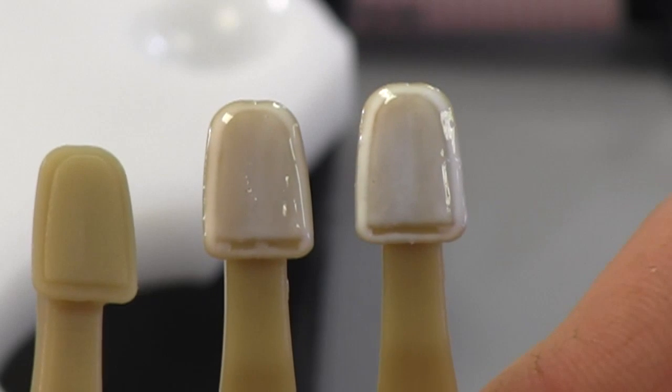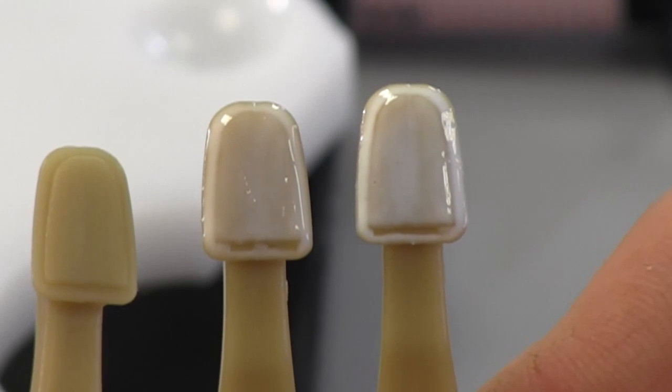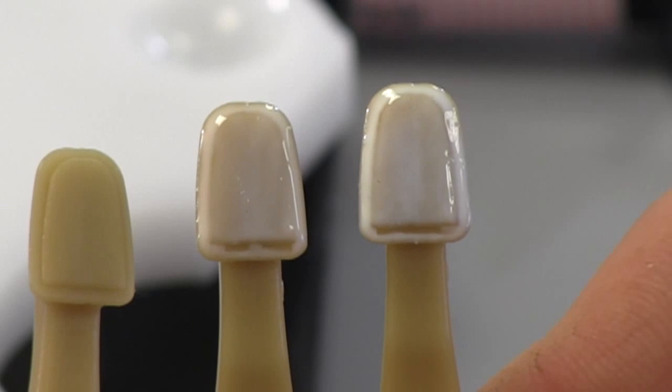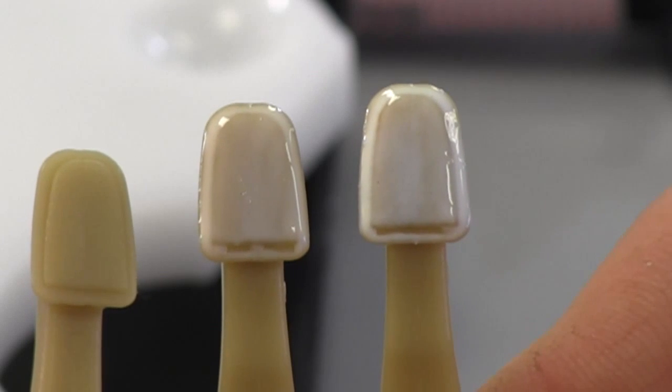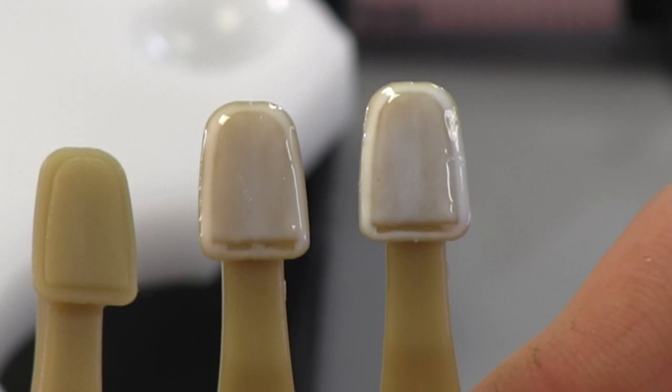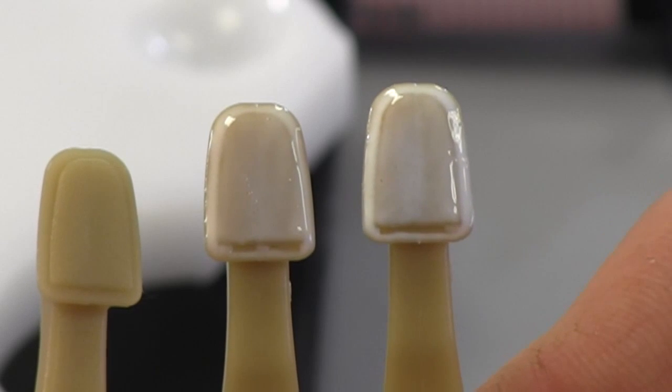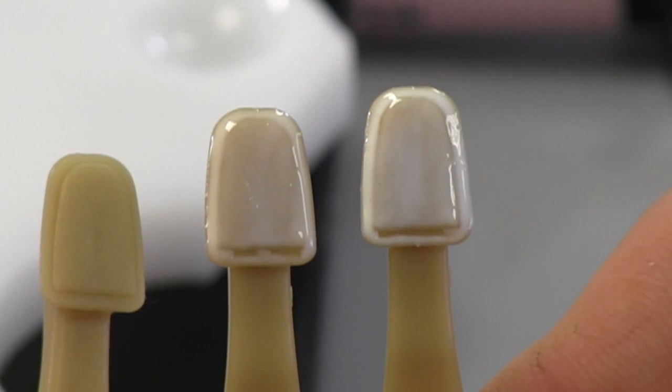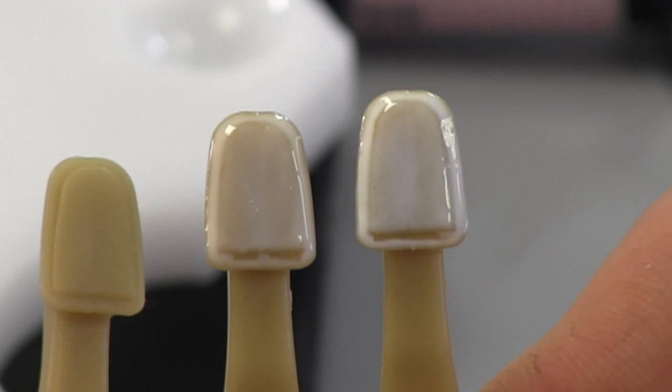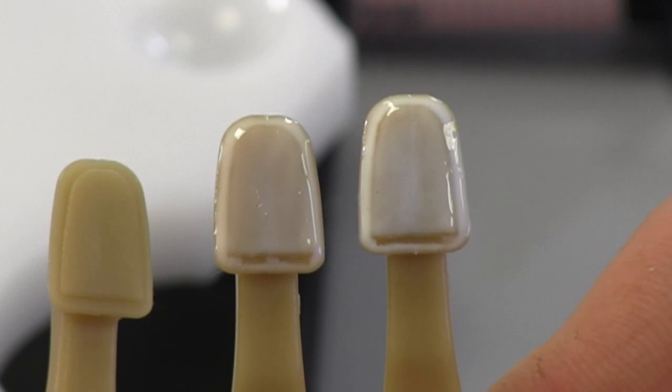And then on the right we placed our White Opaque. As you can tell between the Pink Opaque and the White Opaque, the Pink Opaque tends to be warmer. It absorbs more of the underlying color. By being warmer, when you overlay with your composite, let's say it's an A1 composite, that will allow the A1 composite to look more natural and lifelike. So when you put your next composite over the top, it keeps the value up.